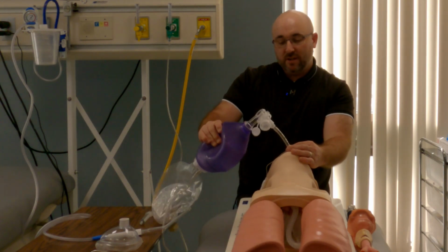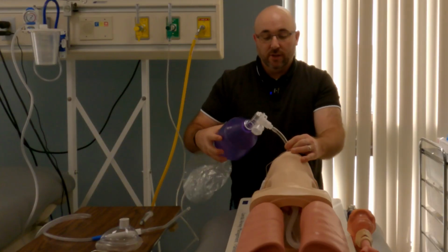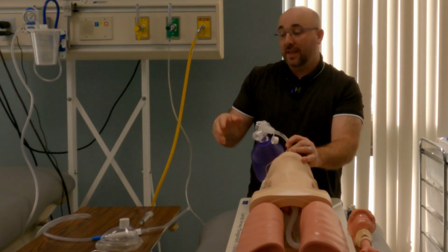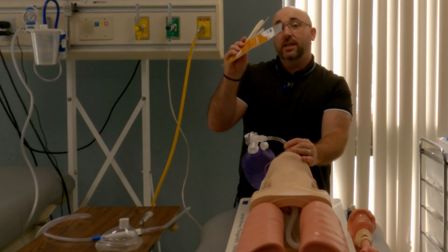So one person over here is ventilating, this person is securing. And then usually what will happen is you'll give this either to the person intubating, and then you go to the third thing on the list, which is the securing device. So now you'll need to secure it.